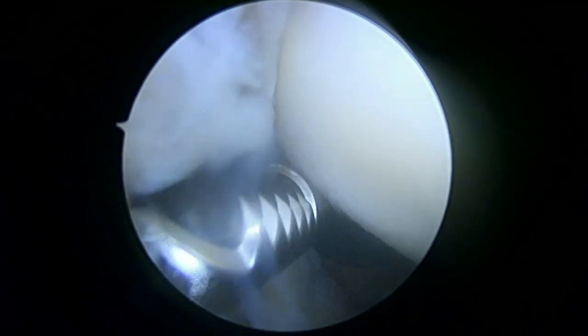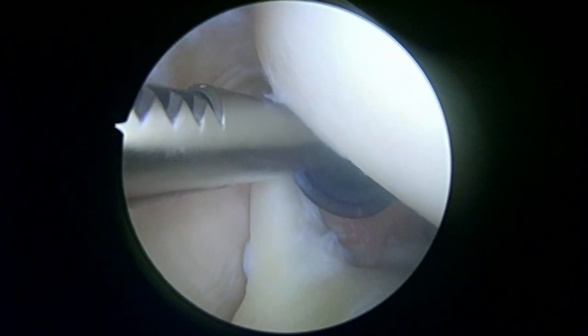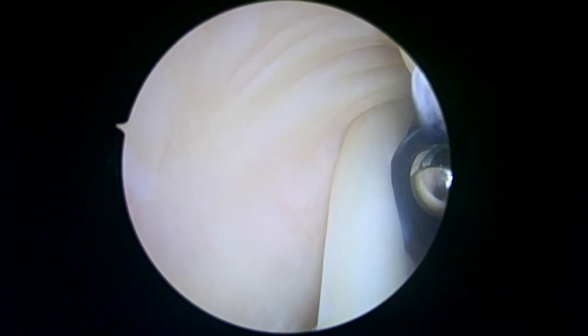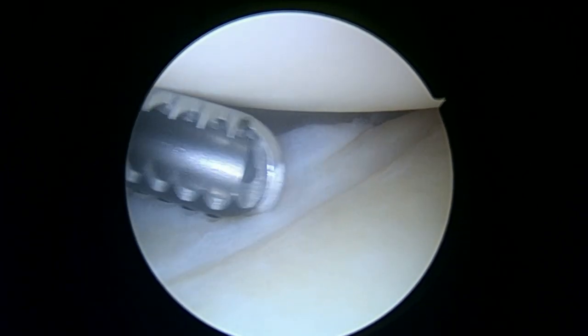We're going to see what else we know — we're going to be looking at the rotator cuff here, and that's this area here. The anterior part of the cuff looks pretty good. It's this posterior part of the supraspinatus we're going to keep looking at. Now we're looking down the front of the shoulder — the anterior anatomy here looks pretty good.